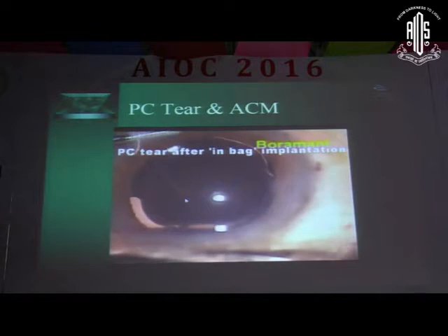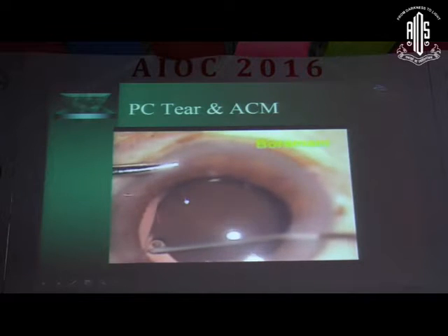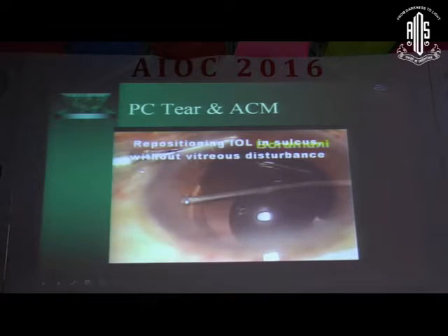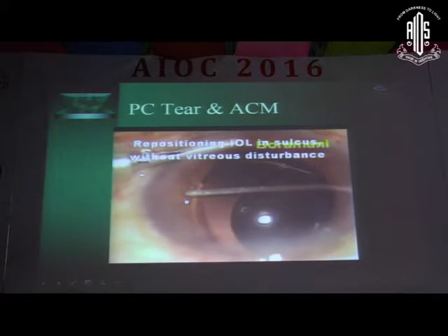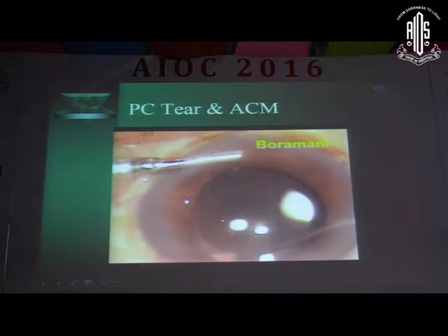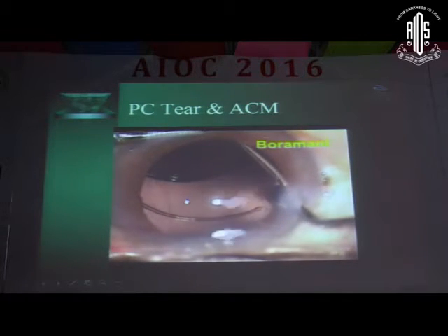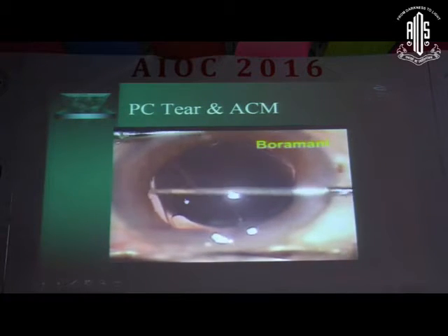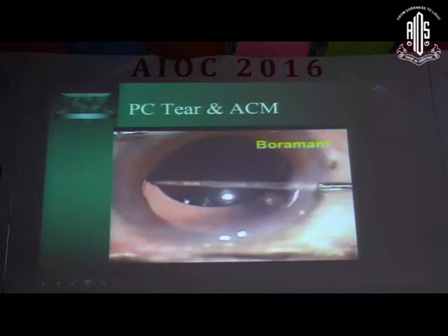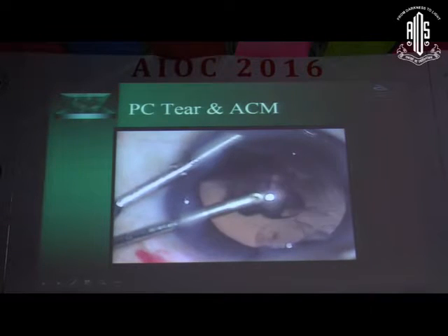Now here are a few videos. In this case, there was a PC rupture which was found after the lens implantation in the bag. Somehow I was scared of keeping the lens inside the bag. So with the ACM on, I slowly removed the haptics, took them out of the bag and placed them into the ciliary sulcus. Because of the maintained chamber, in spite of the rupture, the vitreous was not disturbed.